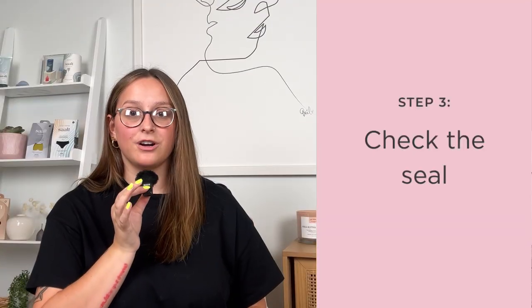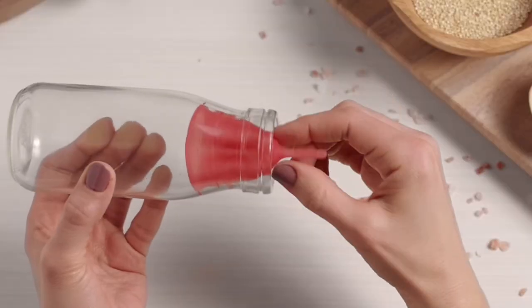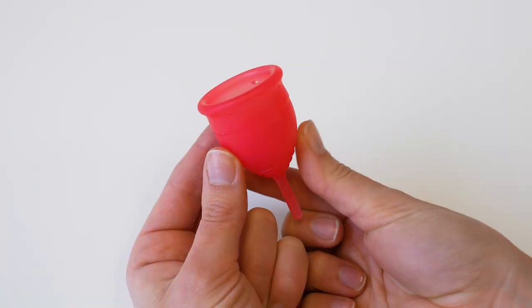Now, we're going to make sure that your cup is safely sealed to prevent any leaks. Once inside, the cup should pop open. But to check for the seal, you're going to run your finger gently along the base of your cup. If it feels flat or pinched, gently turn the cup by the base or push against the vaginal wall to help it fully open. Now, you can wear your Saalt Cup for up to 12 hours at a time based on your flow.